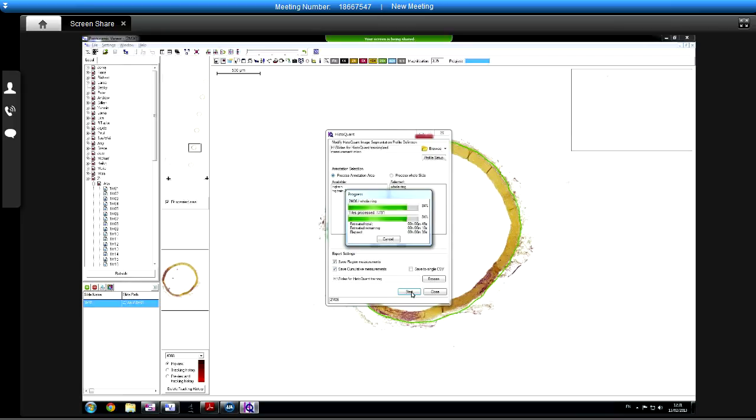That was scanning earlier, and we were playing, and nothing went wrong. No, but it's only one slide. It's the rest of the 4 times 6. I have put on both updates to the drop. Basically, the problem ended up being with the frame grabber card, and we got you to change the settings in a file somewhere as the first stage to fix that. What I've now put on is updated drivers from the manufacturer, which is supposed to eliminate the problem. And I've also put on the very latest version of the software. Don't worry, you will be getting a phone call if it goes wrong. I'm sure I will.